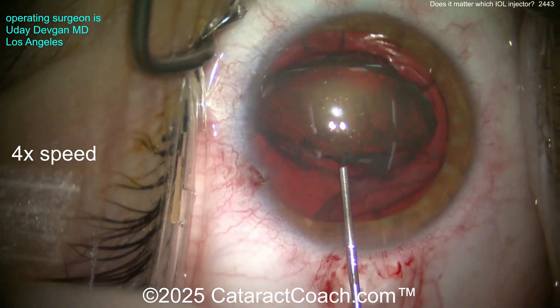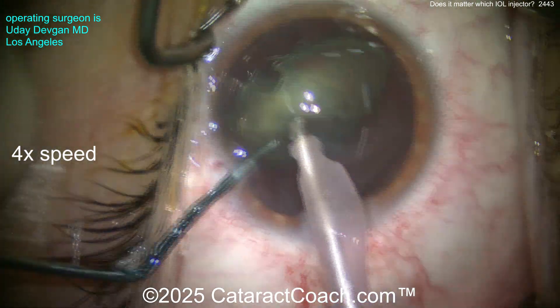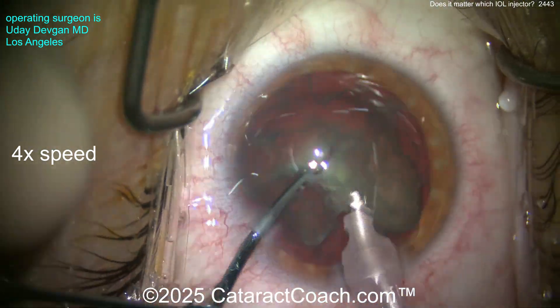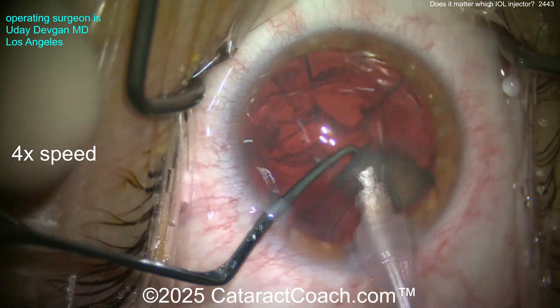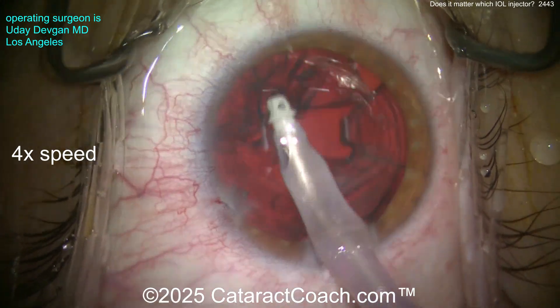I'll speed up the video here. We get the nucleus out of the bag — not too dense, some central nuclear sclerosis — chop the nucleus in half and emulsify it. Obviously a very deep anterior chamber; this patient has an axial length in excess of 30 millimeters. We'll clean up the cortex and then show you the lens.